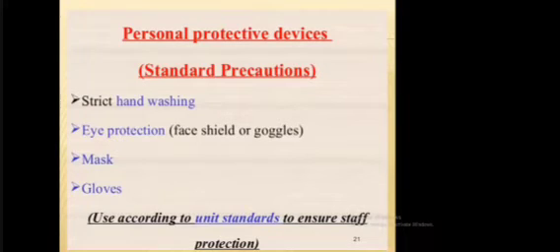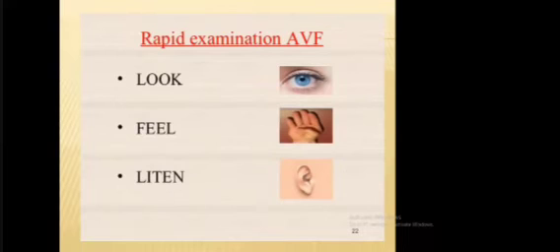So what are the standard precautions to take before cannulation? They include strict hand washing, eye protection, use of a face shield and goggles, mask, and gloves, according to unit standard. Universal precaution is important.